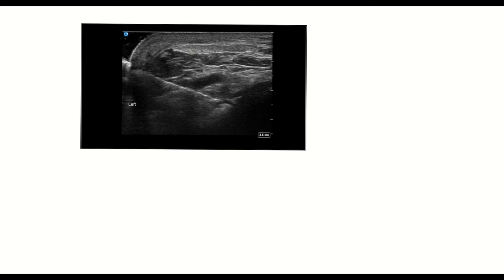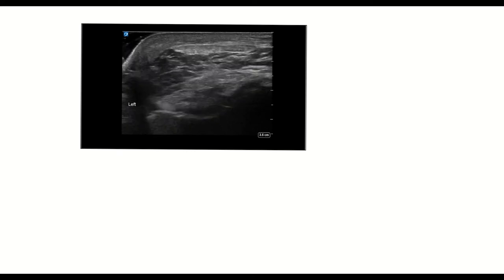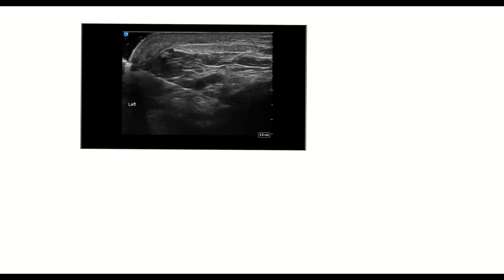Now let's look at the pattern of flow we're expecting when we inject. The fluid is going to flow in this area here, and it will initially be subtle. The most important thing is to see the tip of your needle — that is what confirms your placement more than anything else. In the last few seconds of this clip, the little air bubbles coming from the last portion of the injectate confirm that it is deep to the fat pad and just above the articular interface.